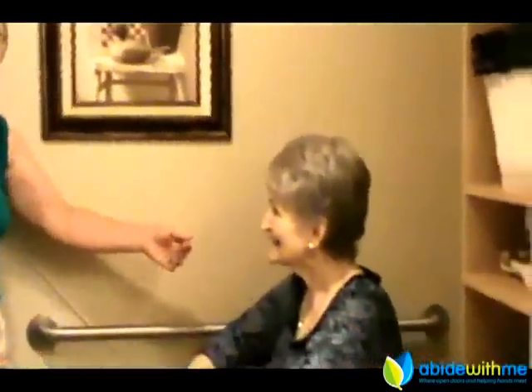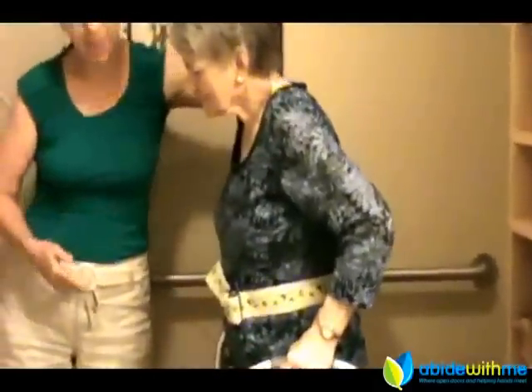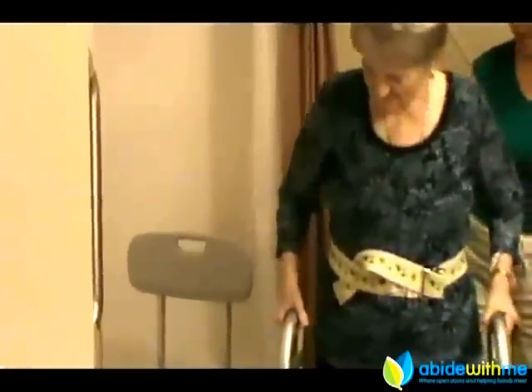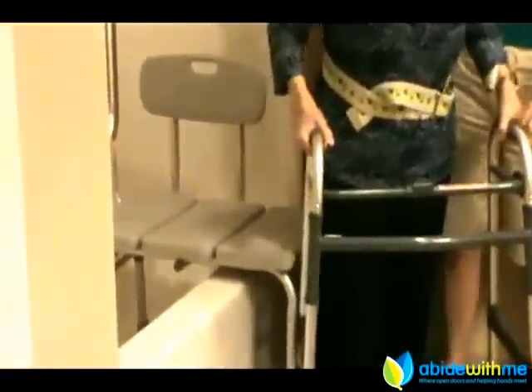Okay Pat, go ahead and stand up. We're having Pat use a walker, which she doesn't really use, so she's learning along with you today. I want you to kind of back up and keep the walker with you. It's always very important to keep the walker with you. Back up all the way until you feel the tub bench behind your knees.